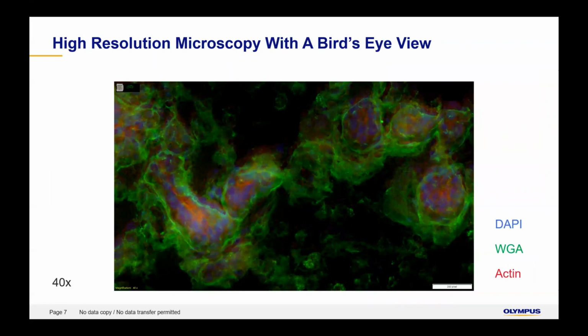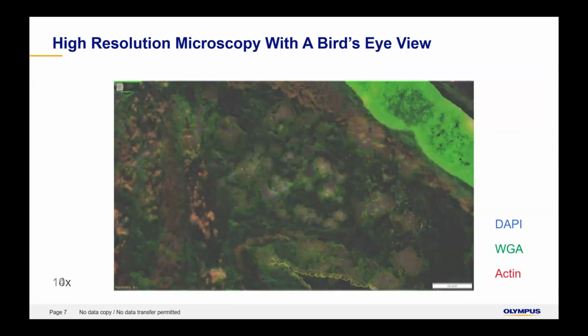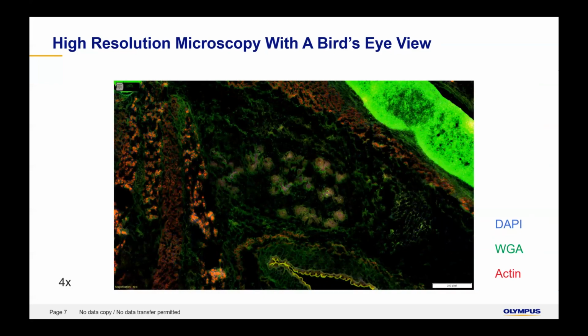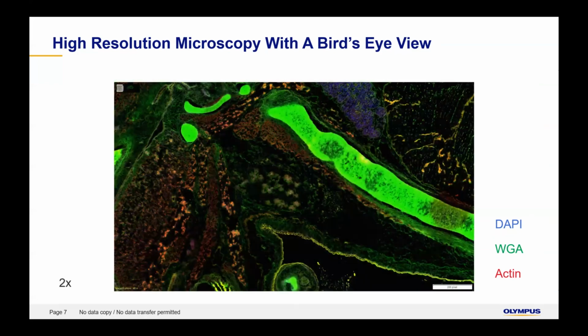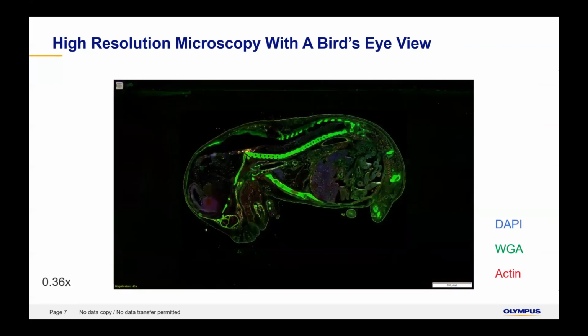And modern slide scanning technology has now progressed to the point where we can image whole sections at high magnification. When you combine this with computer advances that allow a single image to be zoomed in or out, you can view a small section at high mag, like we see here, and you can zoom out progressively to lower magnification to see global localization patterns and expression levels, giving a true macro to micro imaging solution.